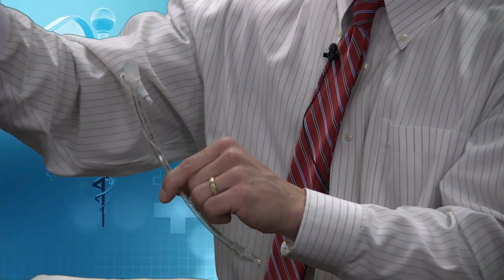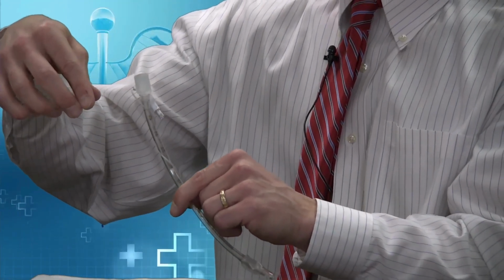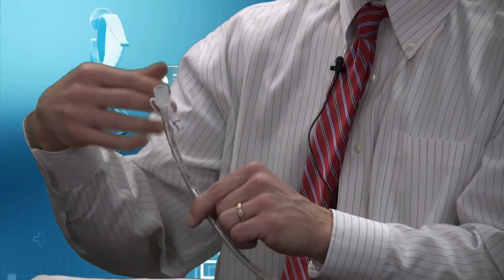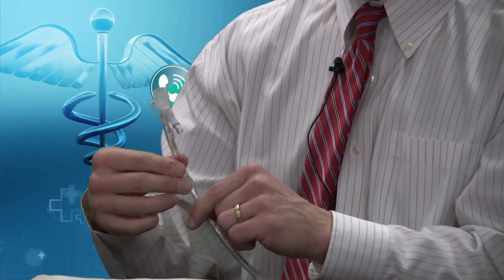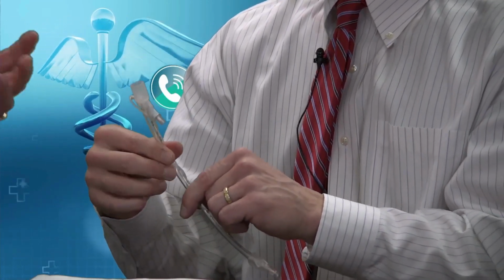So this tube hooks up here to a machine that will deliver an air and oxygen mixture that the nurse anesthetist and you control. That we titrate and control based on the patient's weight, vital signs, and monitoring that we have. And we're going to review some of that monitoring in a little bit.